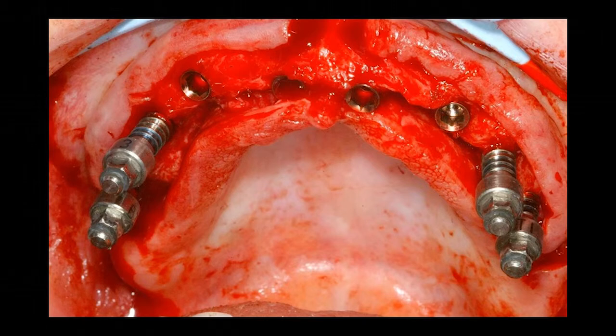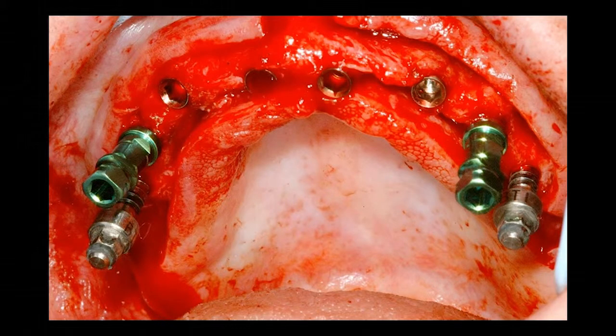So here's the salvage job. We put some minis in there just to try and buy some more time. But look at all of this. This is like, I don't know, Beijing, China, full of bacteria. And that's just my theory, it's not just mine, that if somebody's got active periodontal disease and you put implants over here, you're going to have trouble with those implants in a lot of cases because we got too many bugs growing in the neighborhood. So I went back later, added some more of these. We wound up doing this, and that ain't the end of the story. Look, one of them's missing already.